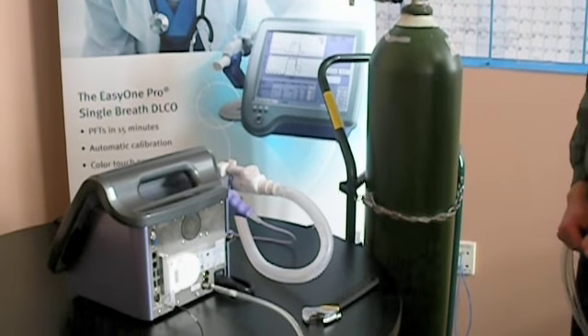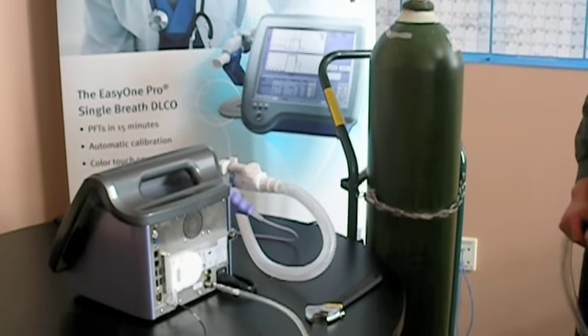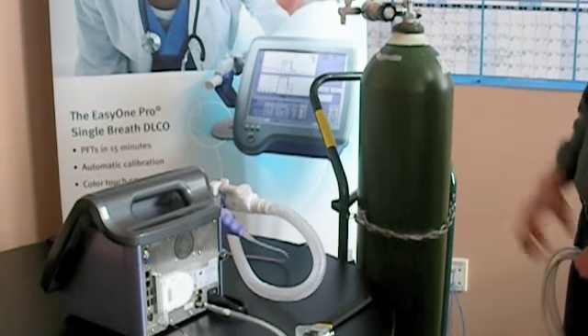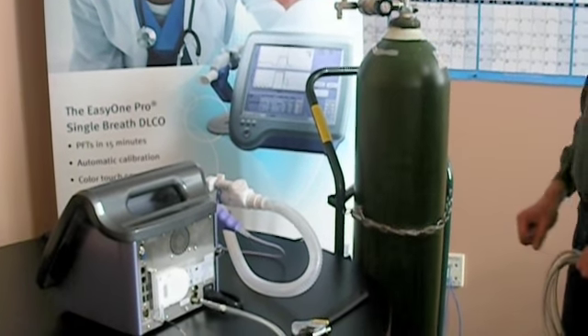This is our NDD Easy One Pro Lab pulmonary system. We're going to connect the oxygen of an HK large-sized tank.